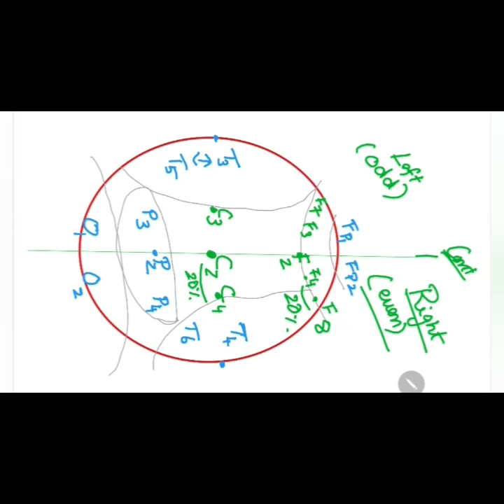Right. So this is how the electrodes are placed in an electroencephalogram. Right. So always begin with CZ and then proceed with frontal electrodes, then parietal electrodes, then temporal electrodes. Right. So this is how you place electrodes in EEG.